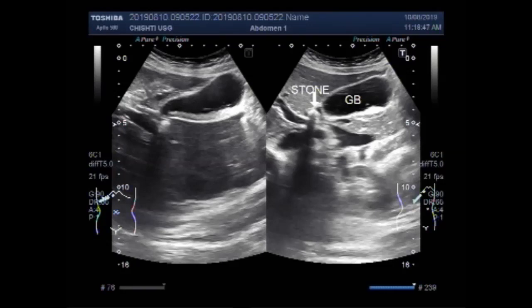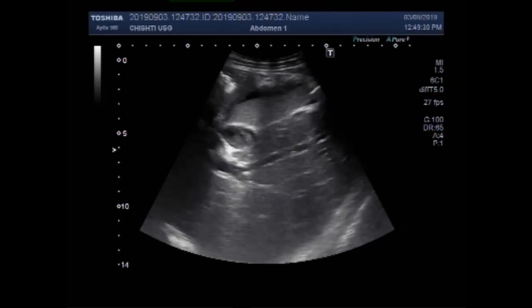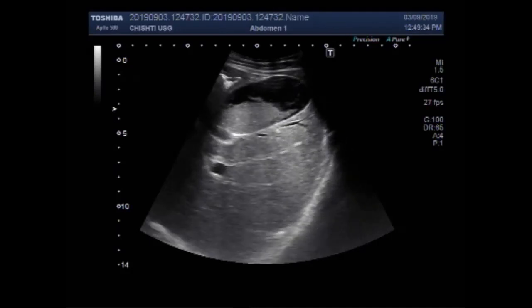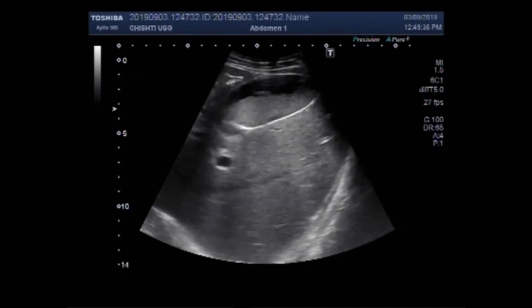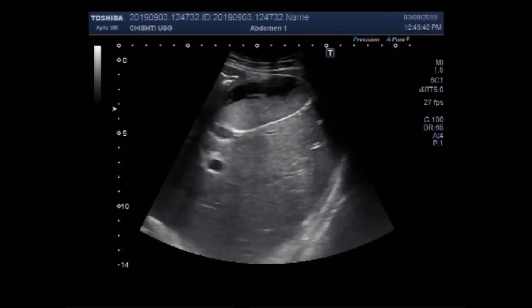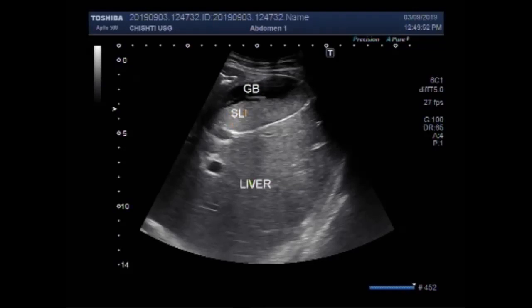The bile ducts are also slightly dilated. Now in the second video, it shows a large amount of thick sludge deposited along the posterior wall of the gallbladder. You can see the whole length of the gallbladder is filled with this thick sludge.